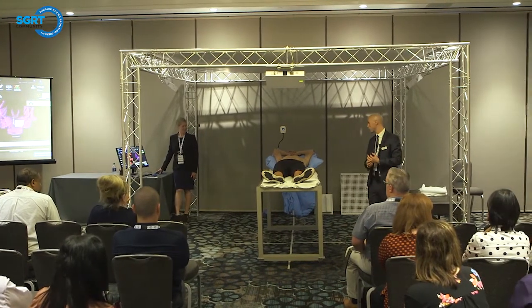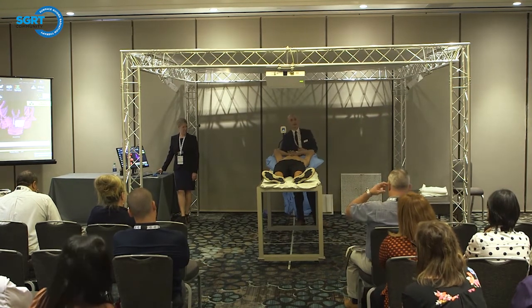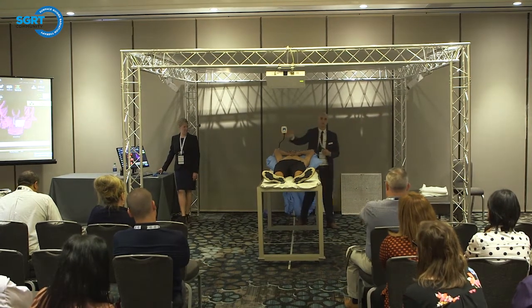Yeah, so it's just a clamp that attaches to the table. You can come up and look at it afterward, and then it attaches up here for the RTC.